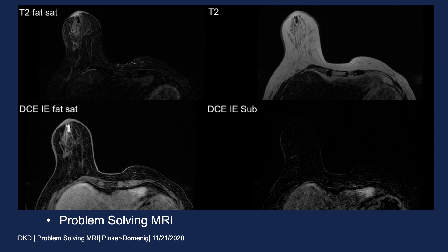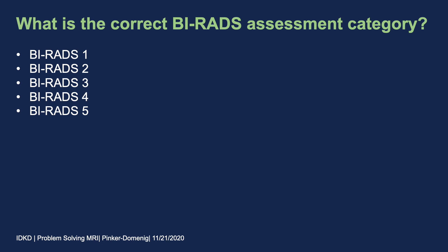Here I have all the sequences listed: T2-weighted, contrast-enhanced fat-saturated, subtraction, and non-fat-saturated T2. We see proteinaceous content — probably with some blood products, which is why it is hypointense on T2 — but when we give contrast and review the subtraction images, there is no suspicious enhancement at all, ruling out an underlying enhancing mass corresponding to the hypoechoic nodules seen on sonographic imaging.